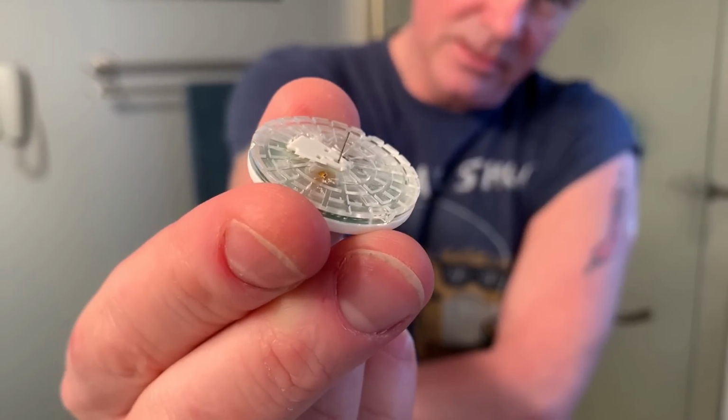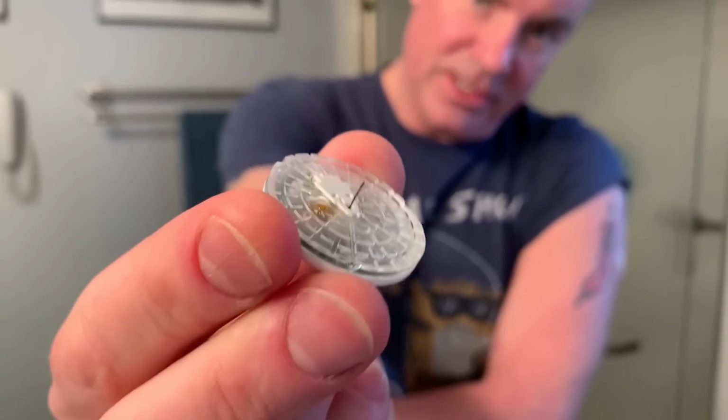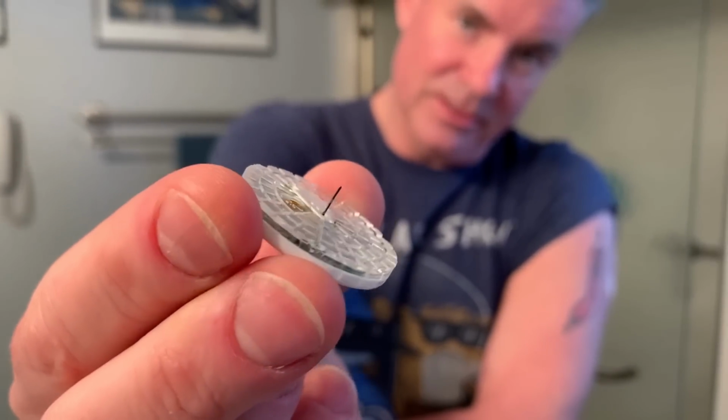The first time I did it, it felt a little bit weird. It really felt like I was pulling off something that was attached to me and that it was going to hurt. It didn't. Don't worry, just sort of get your fingertips underneath there, rip it off. And here you can see what the filament looks like that was actually in your arm. It's really, really, really fine.